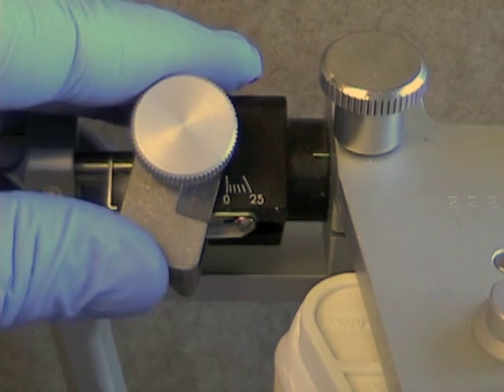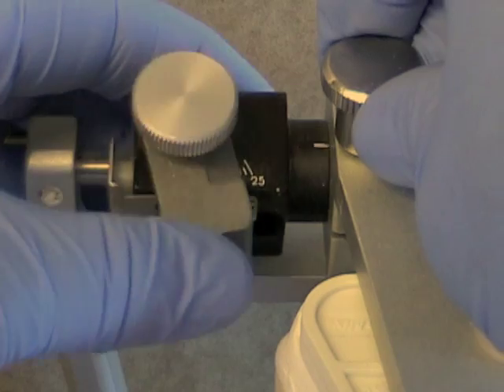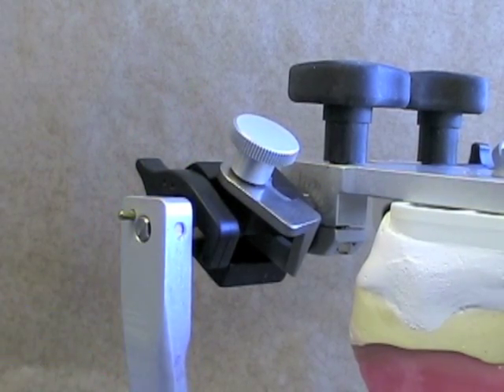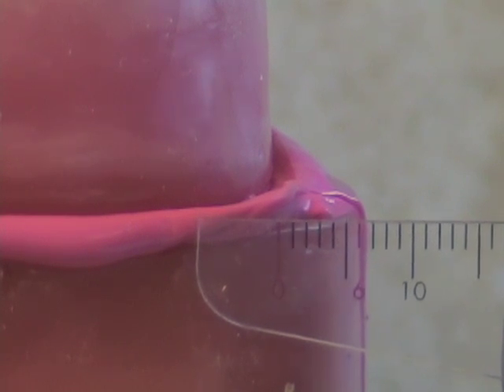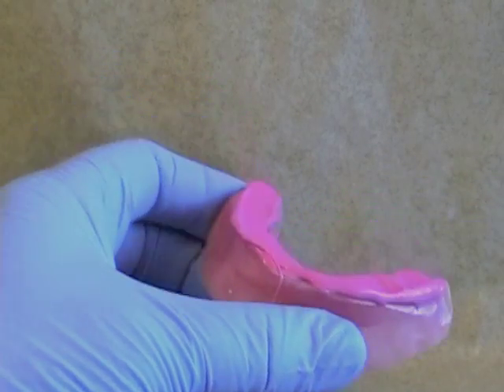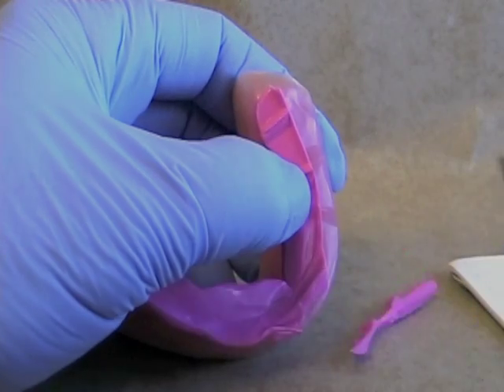Before we seat the protrusive record and set the condylar guidance, we'll set the progressive side shift — the lateral component or Bennett angle — to 15 degrees, as it's almost always very close to that. Then loosen the lock for the condylar guidance. To seat your protrusive record, make sure that the hinge lock is off on your articulator so it can translate. Make sure you have at least four to six millimeters of protrusion — neither too much nor too little. If your bite registration material has squeezed along the sides of the rims, remove that excess edge so it's easier to see the notches and tell when you're fully seated.